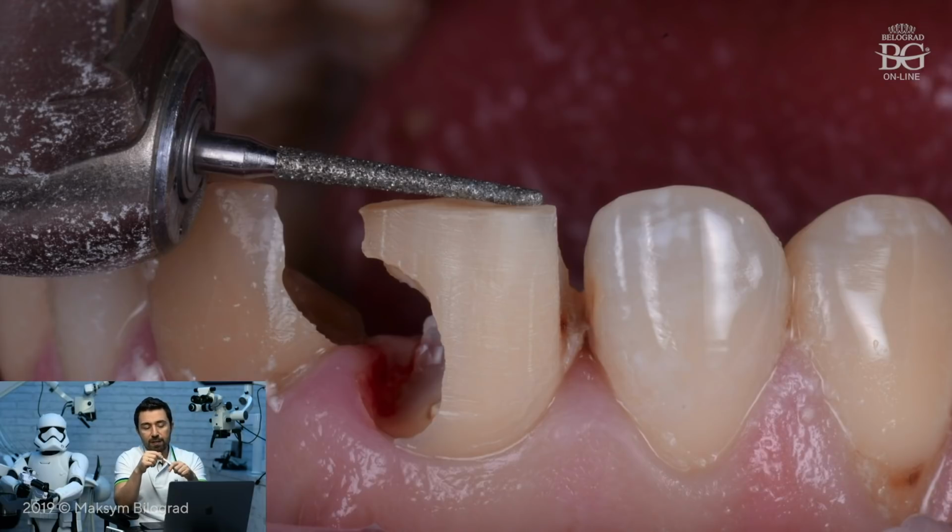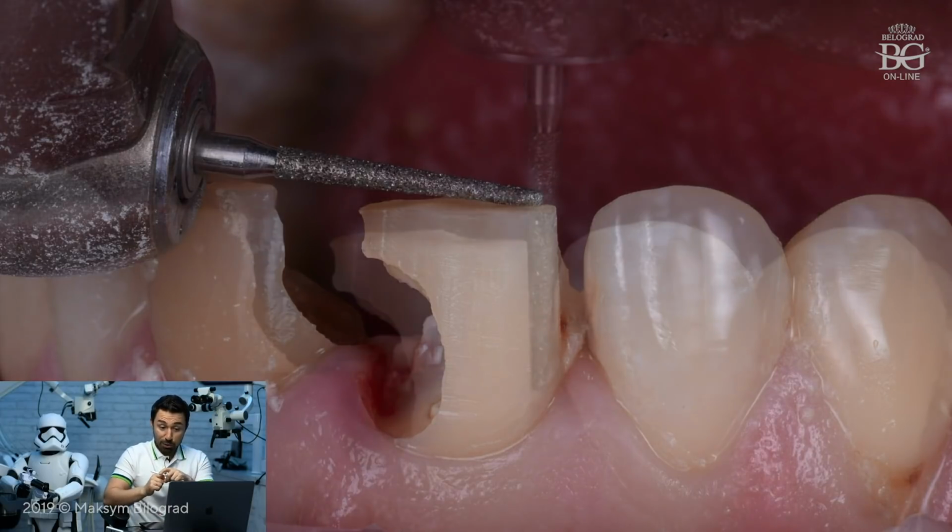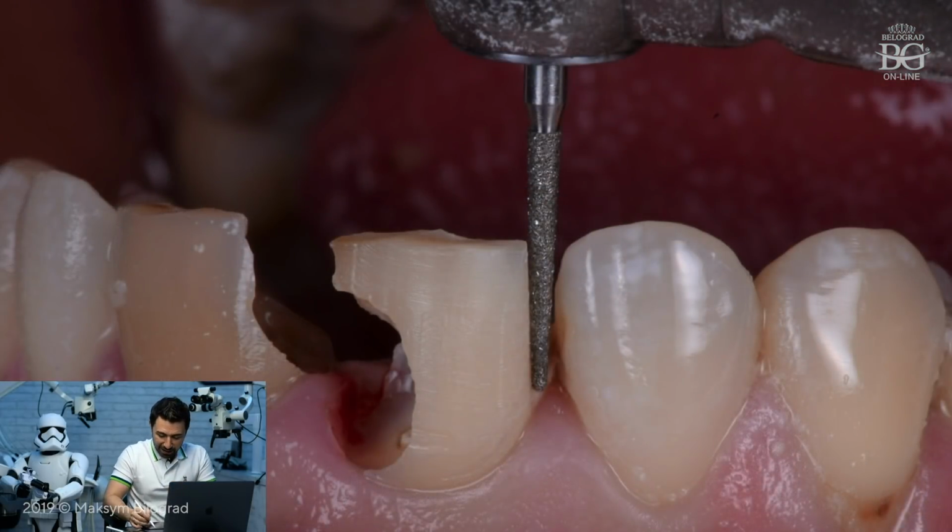And another benefit of that step, when you do step 1 of preparation, is that the working length for endodontic treatment would be shorter, which means it will be easier for you to negotiate the root canals. I would like to highlight one thing here.